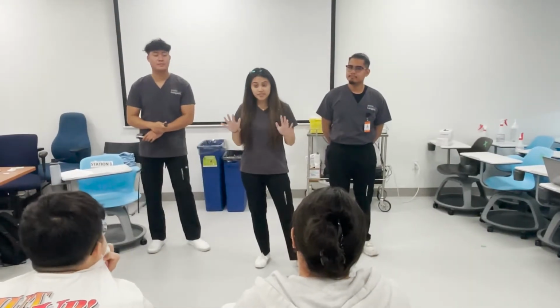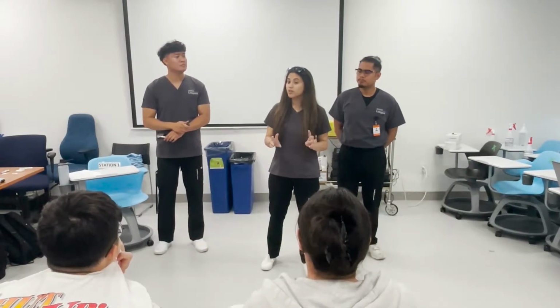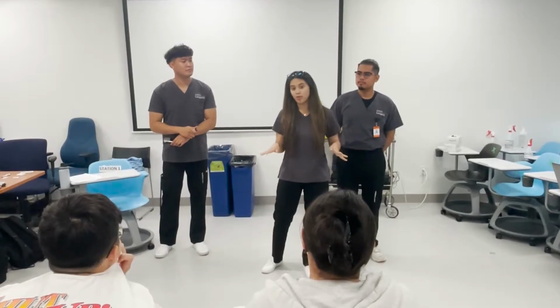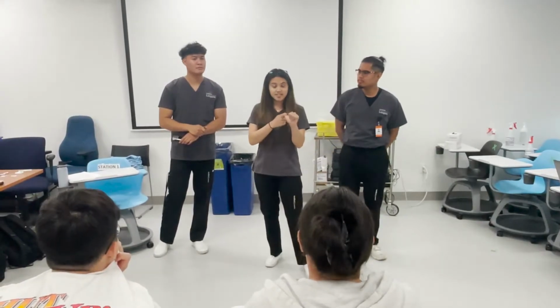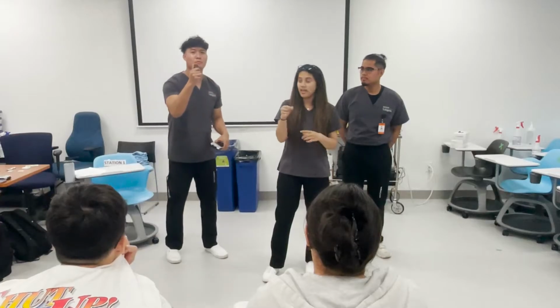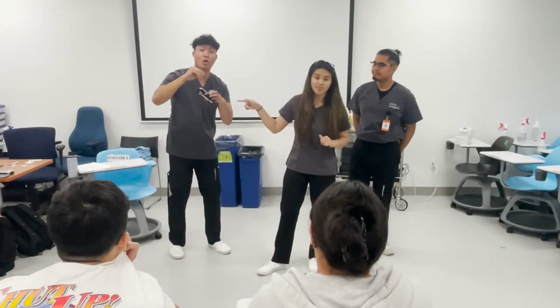There are 5 simple steps to using the glucometer. You might have different ones than the ones we'll be practicing on today, but the 5 steps remain the same no matter what. You just make sure that you read your specific instructions for whatever device you have, okay? So the first step is always to grab the glucometer stick, and we're going to take it from there and insert it into the device, okay?